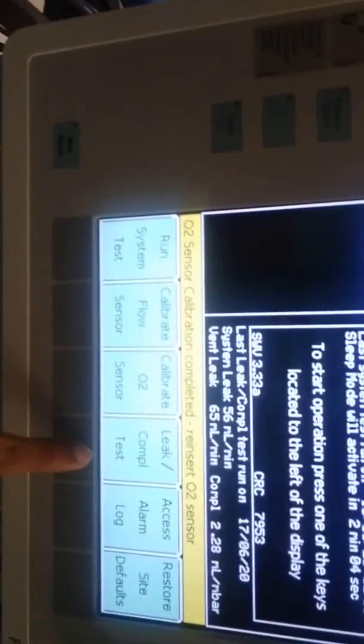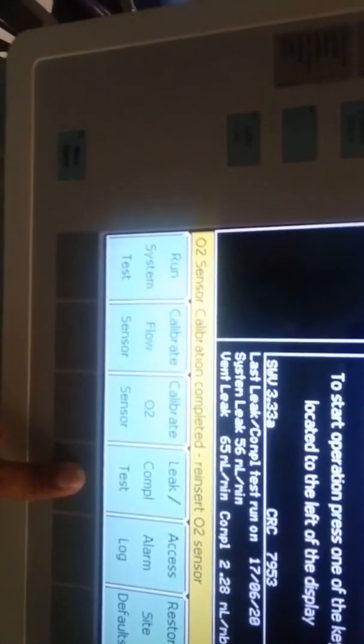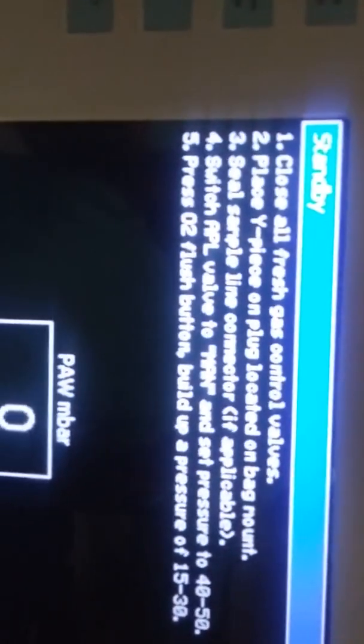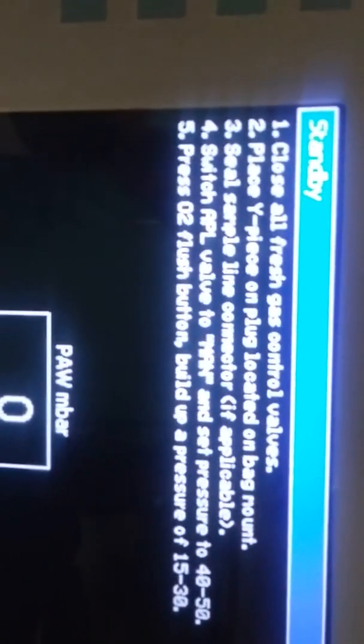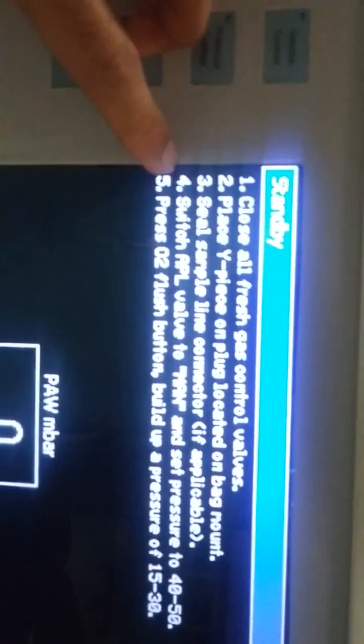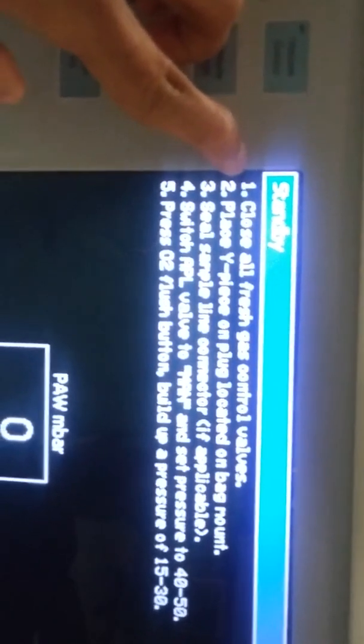Next step is leak and compliance test. First select the option and we can get a new window about mandatory steps. First step is close all fresh gas control valves by rotating clockwise. Close the valves rotating clockwise. Rotating anti-clockwise opens the valves. We should confirm that all gases like oxygen, nitrous oxide, air are in off position. The leak test is performed by workstation itself. After that proceed.